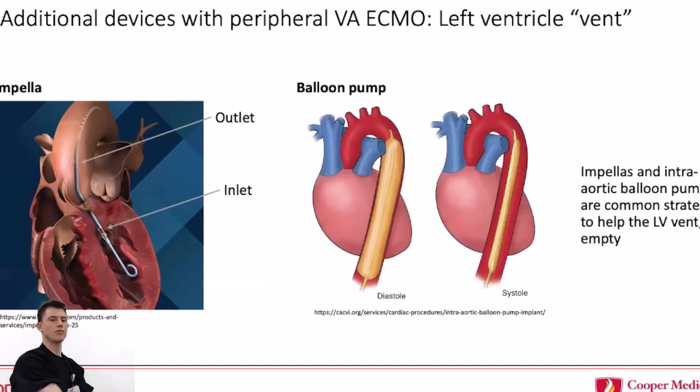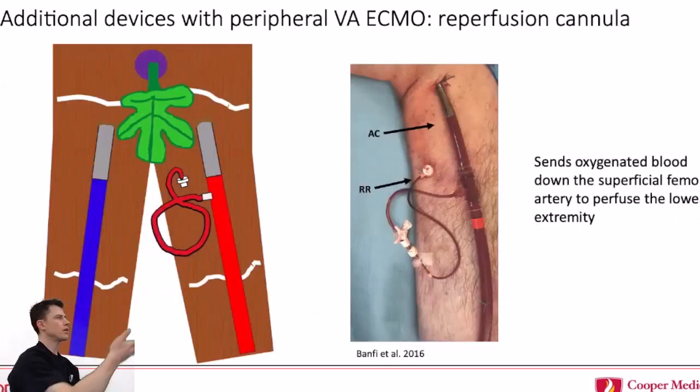That's particularly true if you have a cannula that's going in one of the extremities. The other thing is, if there's not much blood flow going there, it may be just trickling down there. You're not going to feel a pulse. So having the Foresight on there, you can see a difference: the perfusion on the foot that doesn't have the cannula in it is doing fine, and there's a lot less perfusion on the other foot. So, okay, we probably need one of these cannulas.